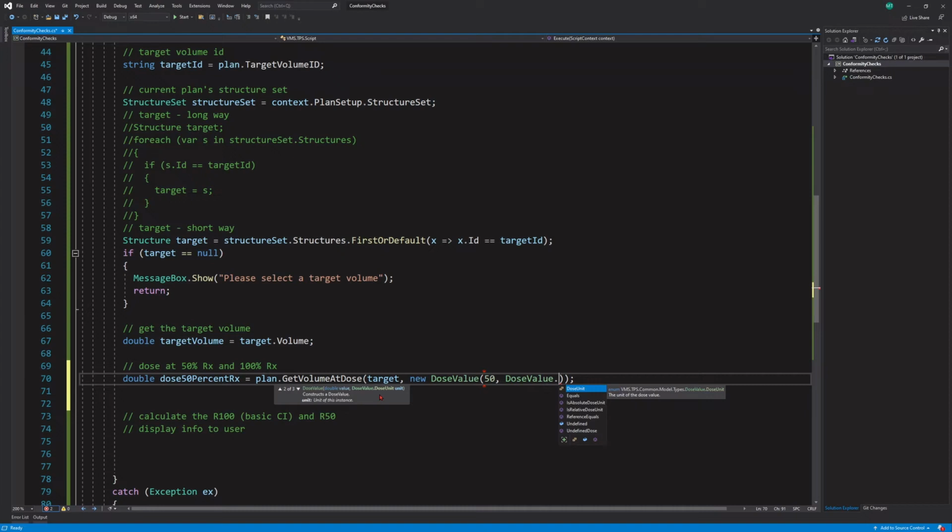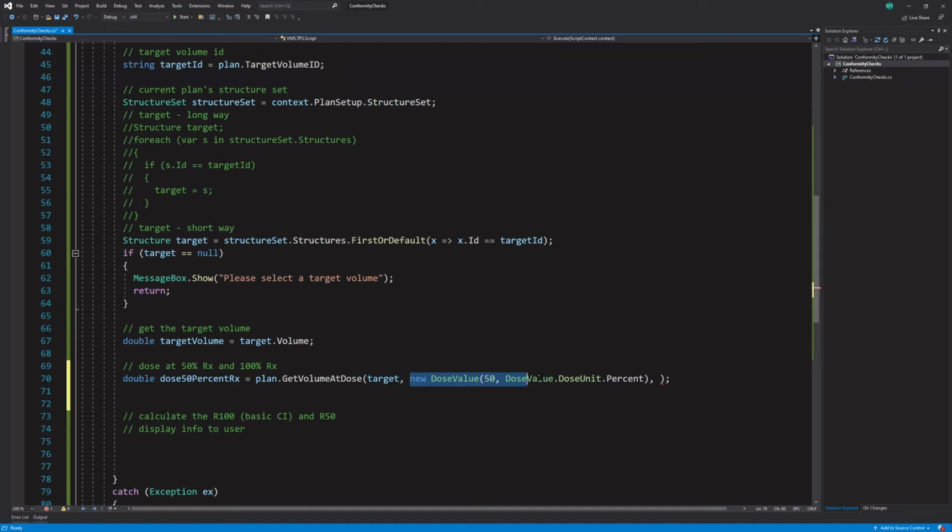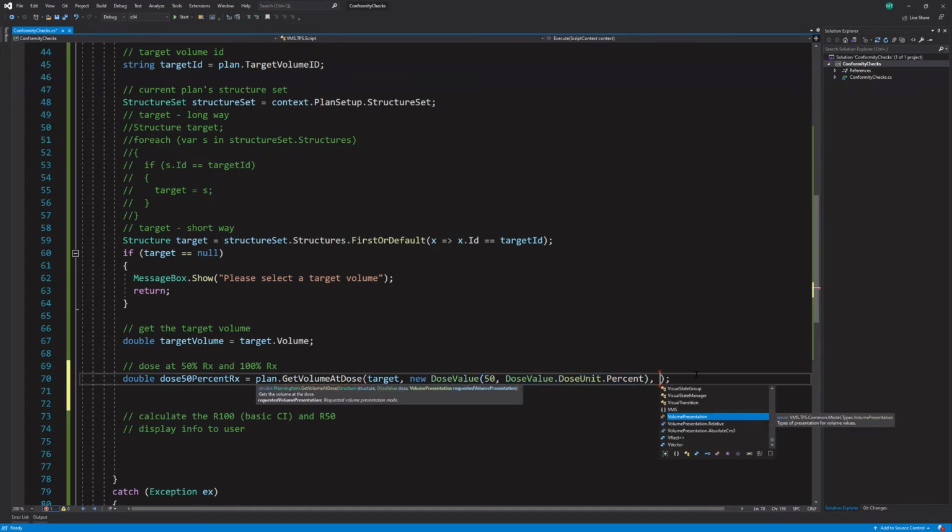Value dot dose unit dot percent. Okay, so that's a new dose value. And you know, the other thing that we could say, we could take this out and we could make a variable, but see, we can declare it inside it. So that's just what I like to do. And then I forget what the last one was.